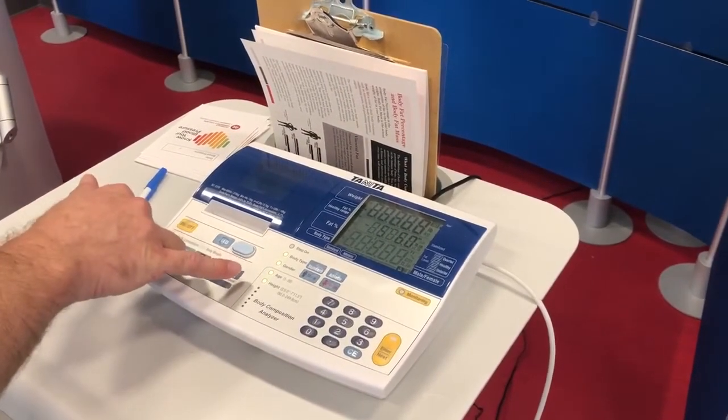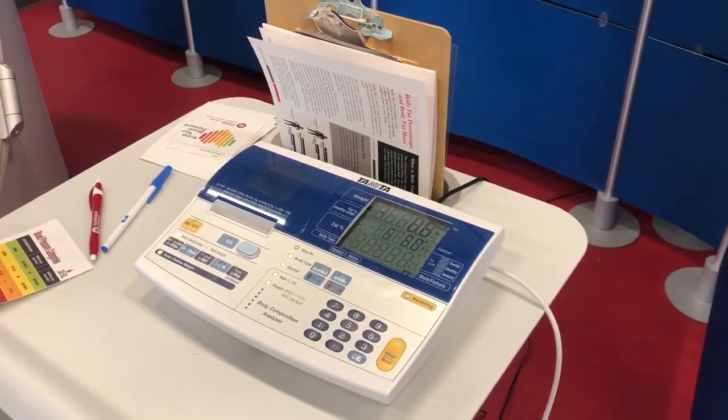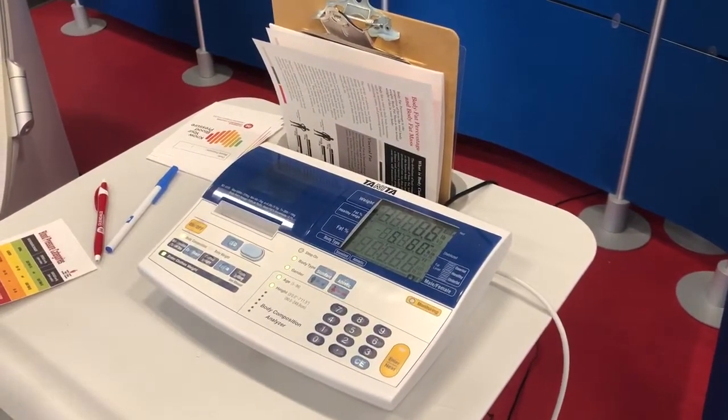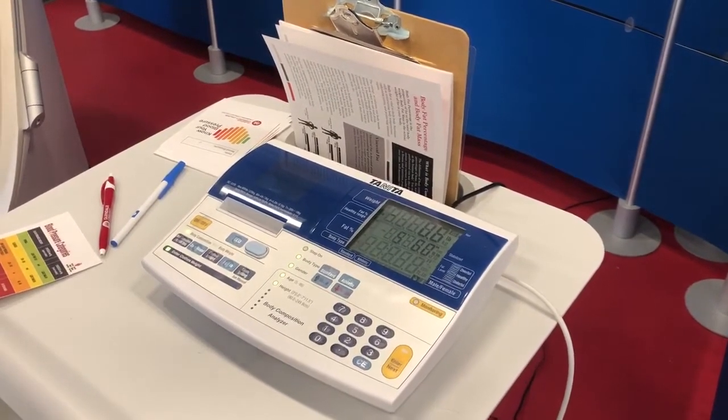The Tenita is going to then prompt us, after clearing, for our client to step on. At this point, our client would step on the scale, and then we will receive our printout, and we will discuss the printout and normative values with our client at that point in time.